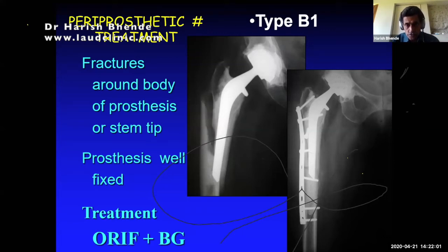So you must have a plate which is long enough to have an anchorage into the trochanter. What you are seeing here is a plate which is going from the trochanter, but it would have been preferable to get that plate right up to the tip of the trochanter, and probably you could have taken the plate a little bit longer and given maybe 1 or 2 screws more, because there are just 2 or 3 screws in the distal fragment. So we must neutralize this fracture, when put together by cerclage wire, by using a long plate, so that the torsional forces are prevented.